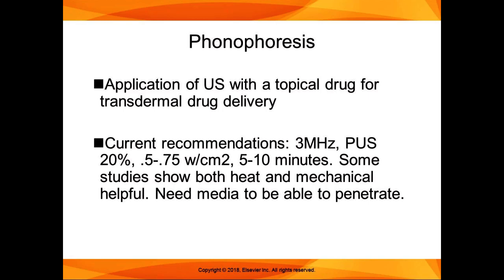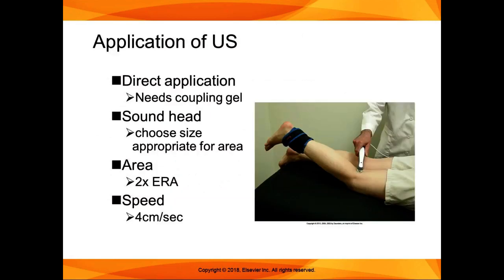I've really only ever been in one clinic where phonophoresis was done on a regular basis, and it's not unlike just performing an ultrasound. The main difference is the medium that you use. So when you are doing a direct application of ultrasound, you need a coupling gel. There are some different ultrasound gels you can use, and we will try them in the lab.